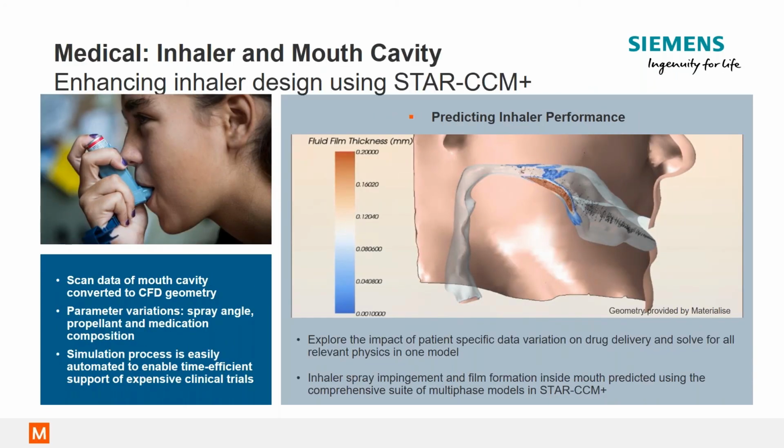And here we've got another inhaler application. And so the main challenge for optimal inhaler and drug design is to understand the flow behavior in the mouth cavity, but also to understand the dosage required to reach the lung branches. And part of this design process is to understand how to vary spray angles, particle sizes, or medication composition. In this case, STAR has been used to optimize the spray angle using Lagrangian particles and the fluid film model in order to efficiently deliver the medication to the lungs.